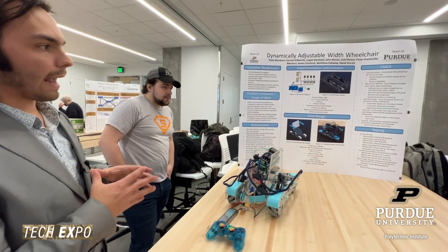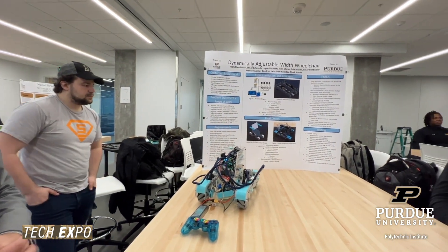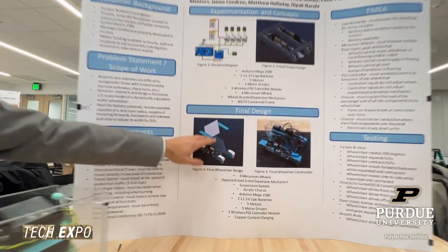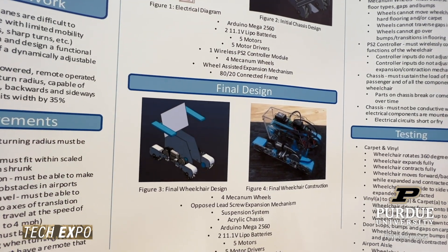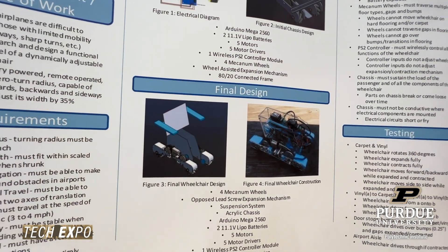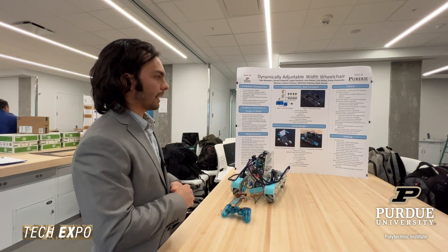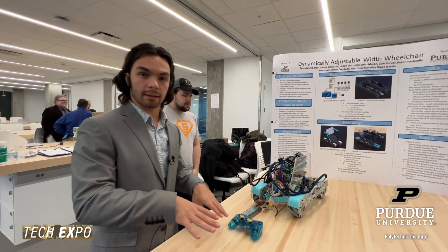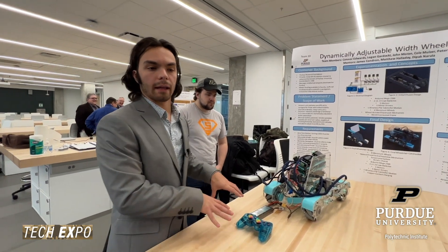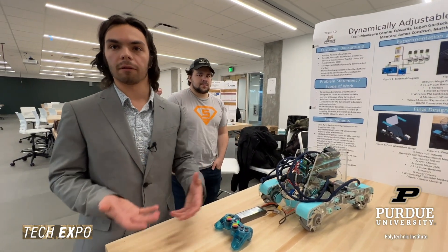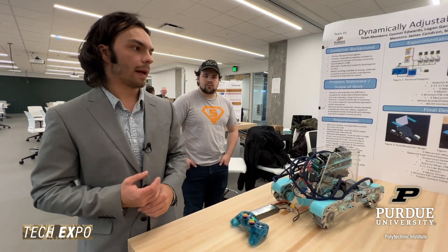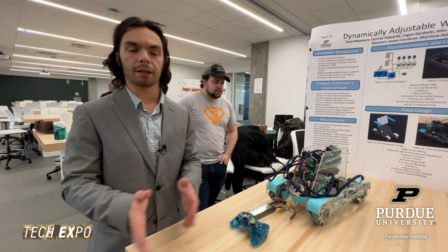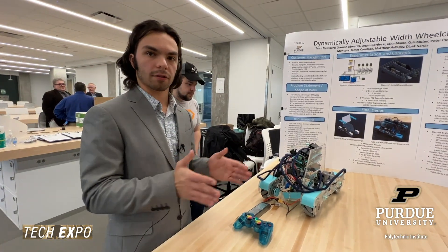The final CAD rendering shows the full design, including where the back of the chair and arm braces would be added aesthetically. Once assembled, we tested the device on vinyl surfaces and low-pile carpet to simulate the floor surfaces typically found in an airport. We verified whether it could transition between surfaces, turn on those surfaces, travel omnidirectionally, and expand and contract.